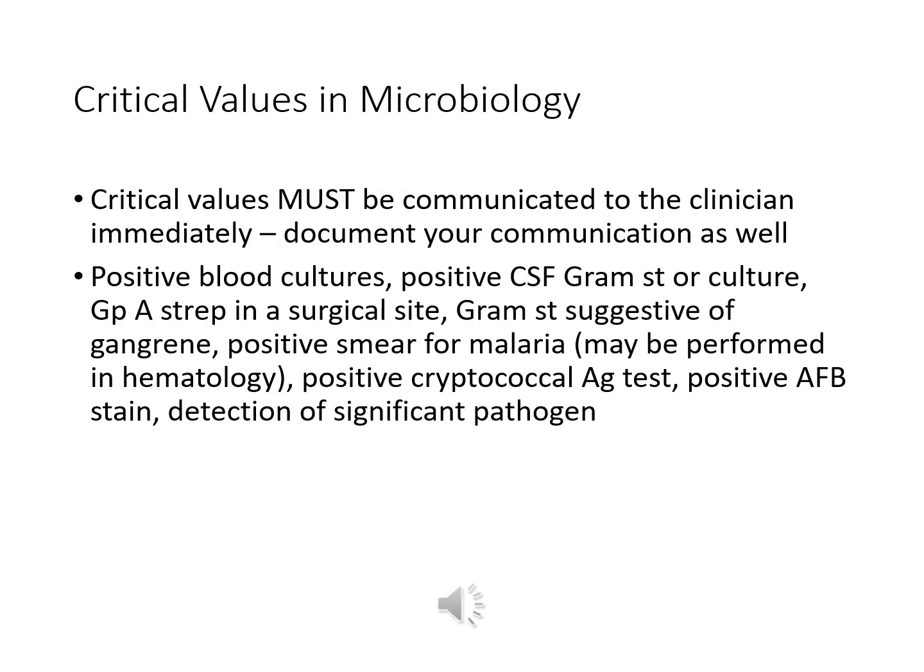Critical values in microbiology. So we do have some critical values in microbiology. Micro is going to take some time as far as growing the culture and things like that. So you may not technically think of them as critical like you would in hematology. But with that said, we do need to make sure that we are communicating to the clinician immediately if we do come across these critical values. And then making sure also, as your protocol would mention, to always make sure that you document who you talk to, date, and time. So some examples of critical values in microbiology, any blood cultures that are positive.